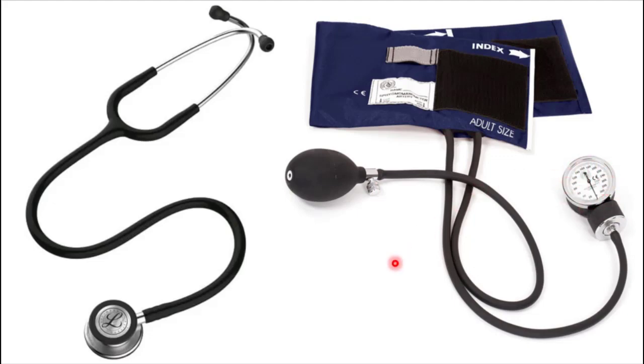And why blood pressure is somewhat complicated is because you have a lot of things going on. You're trying to listen, you're holding this, you got to make sure this is on the patient's arm, you're supporting the patient's arm, you have to make sure this is in view, and you are deflating at a decent rate, and then trying to listen intently to when sounds start and go away. So this is your equipment. It looks very simple, but it's going to be a juggling act trying to get this down for your first couple of tries.